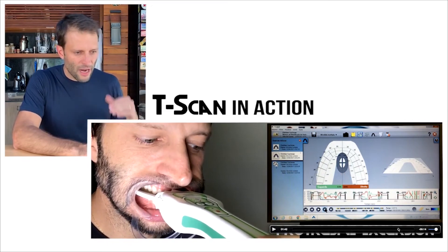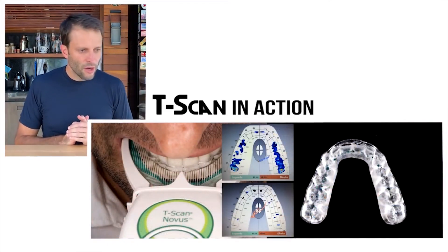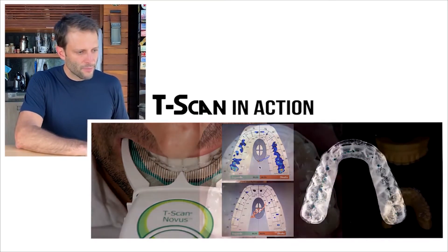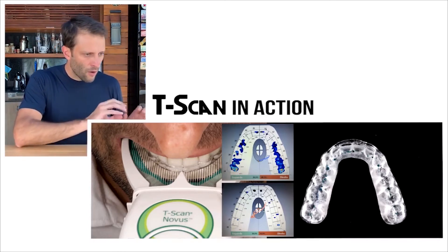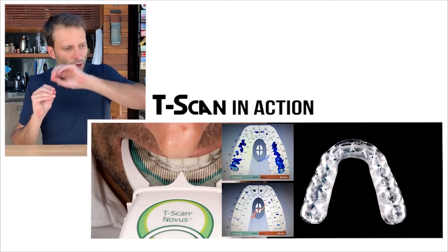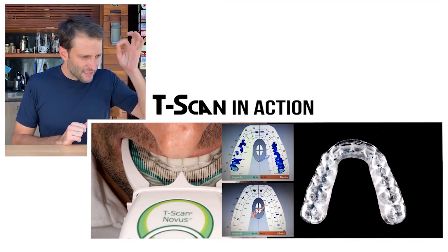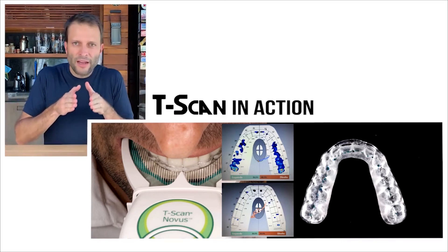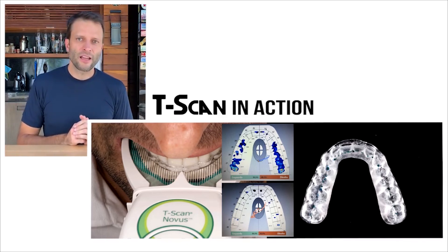I can do that several times repeatedly, and here I'm doing it on the night guard. What we see is the night guard being adjusted with T-scan, and you can see how I was able to adjust my night guard so that the load distribution is pretty equal — that's great. The center of forces, shown as a red dot, is right in the middle where it should be. I did a great job adjusting my night guard.